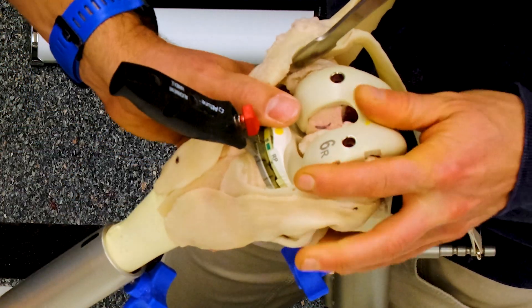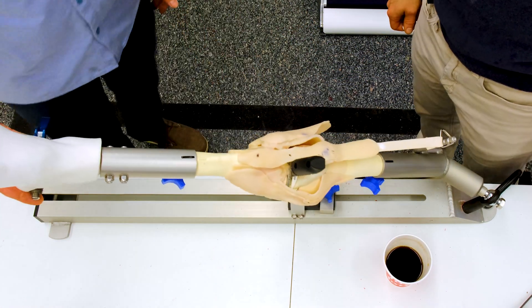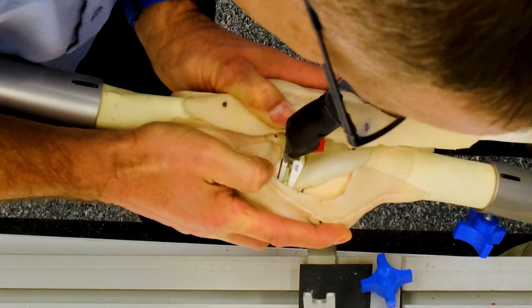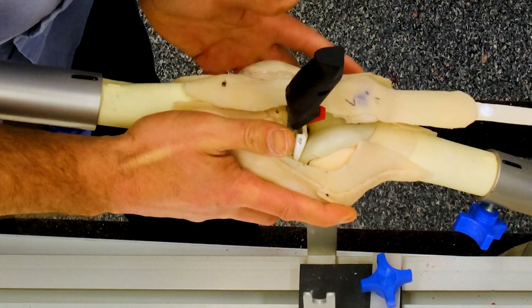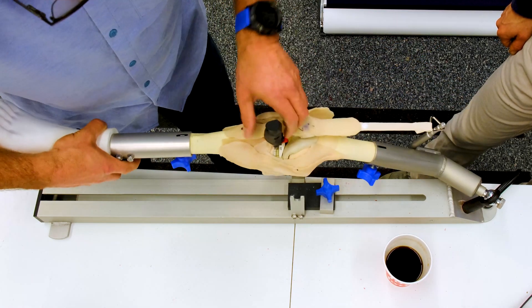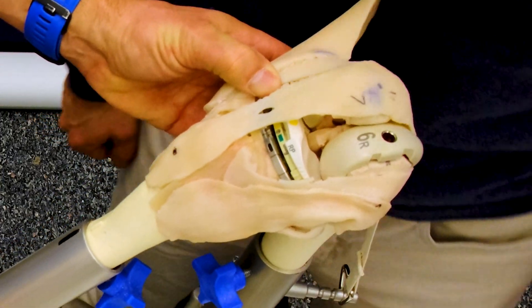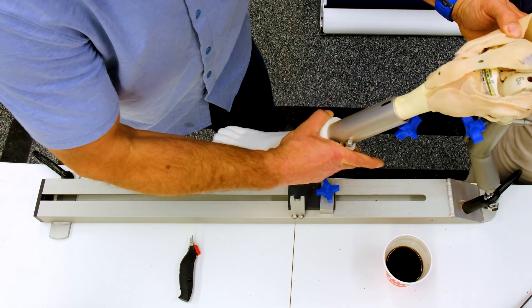That's a tighter fit. I'm going to take it out into extension and now we go to full extension — there's no flexion contracture. That feels good. If I stress it in valgus and varus, I get about two or three millimeters of lift off with valgus stressing, and two or three millimeters of lift off equal on the lateral side with varus stressing. As I take that through a range of motion, it's flexing far better than it was with our bigger, thicker poly.